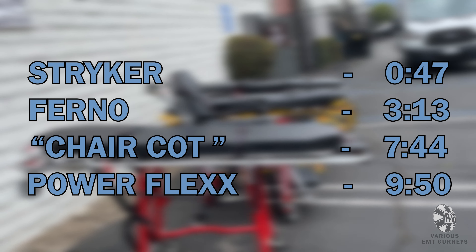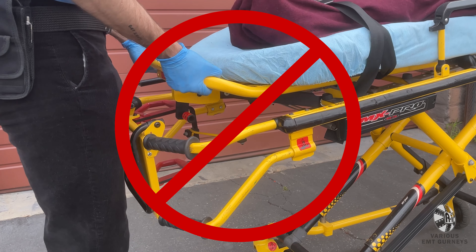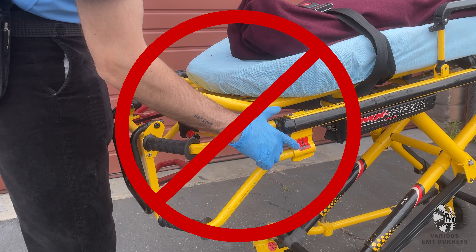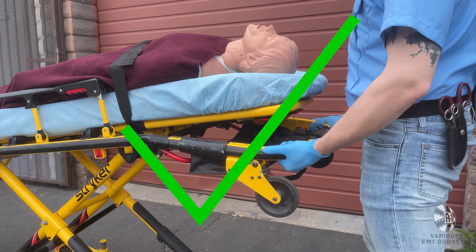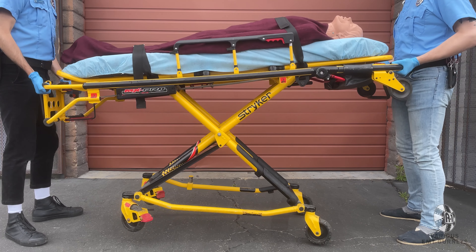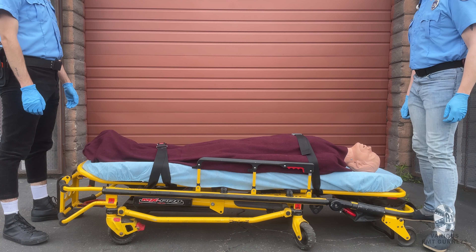The easiest way to raise and lower the Stryker EMT gurney is with two people, one on either end. To lower the gurney, have the operators grab the frame with an underhand grip, making sure not to grab the footrest, backrest, or a pinch point. Both operators will lift slightly, and then the person at the foot will pull the release lever. Continue to hold the release lever and slowly lower the gurney until it's in the folded position.